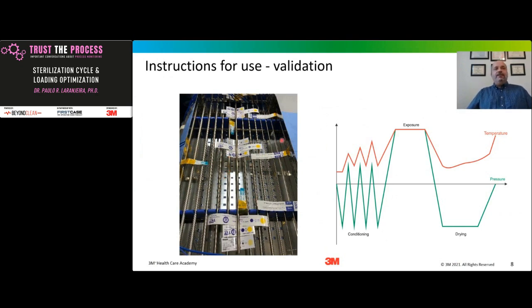So we have different lumens here, different sizes with the same length, with a plastic holder, higher height in the end, lower height at the front. And during the research, I used a lot of chemical indicators in there to understand the behavior of the indicators versus what was going on with the load.